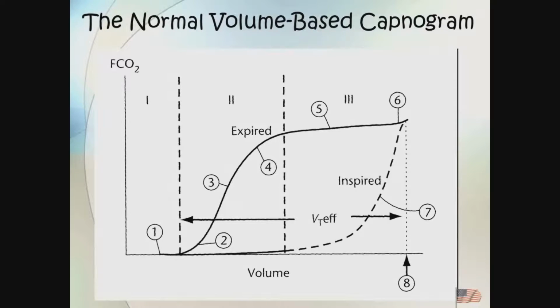This is what the graphic would look like under a volume-based capnogram, and it does have different phases, not quite the same as the phases on a time-based capnography, as we'll find. And there's a couple of other things that we're looking at here. What you're really looking at is plotting the exhaled CO2 against tidal volume, or against volume that's exhaled.